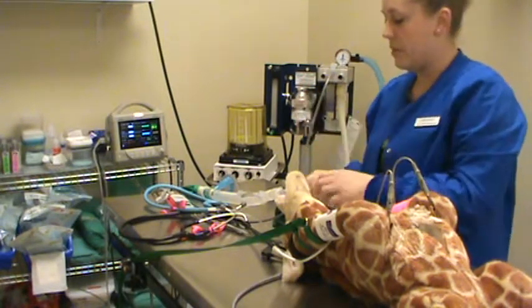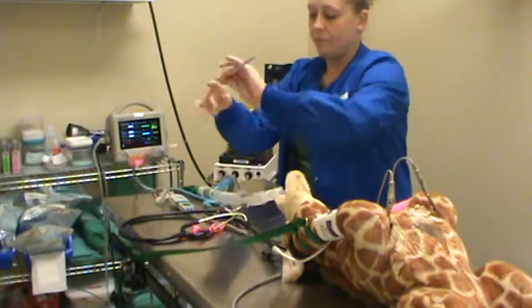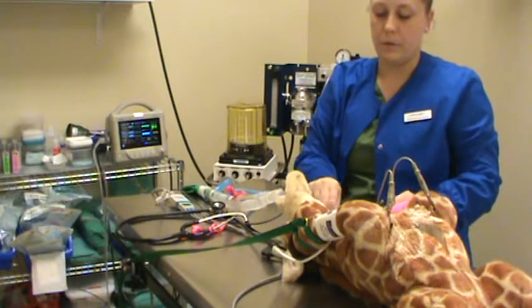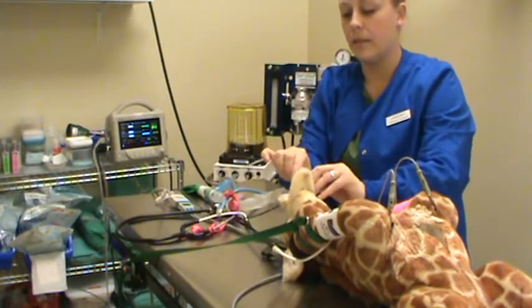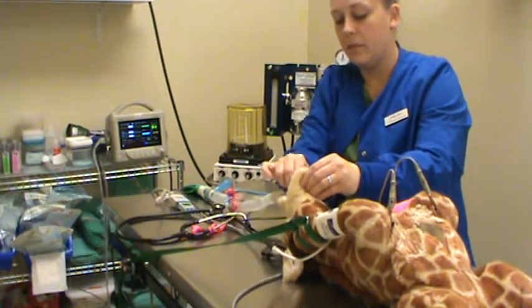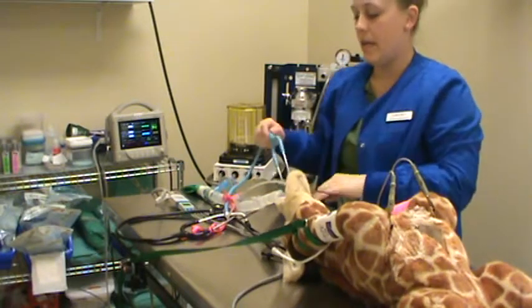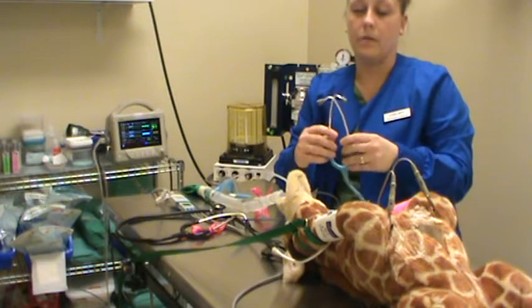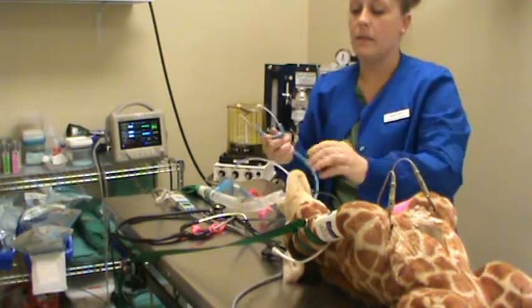So the next part of the monitor that I'm going to put on here is our esophageal stethoscope. So we have this handy dandy little stethoscope that we also lubricate and stick down. This is going to also go in the esophagus. This little guy sits also next to the heart. It's going to sit right up at the midline, and it takes a really good heart rate. So you can stick these in your ears just like a normal stethoscope and take a listen to the heart.